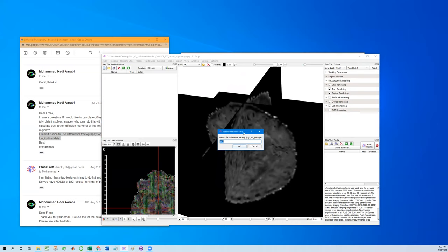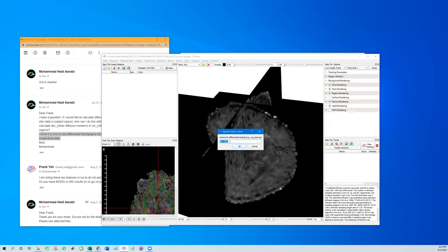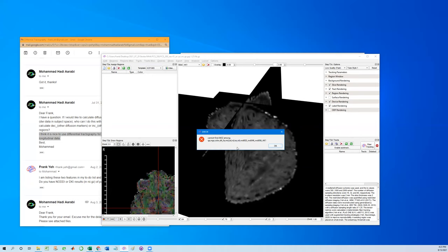To track decrease of axial kurtosis, what we are going to add is the first kurtosis minus the second one. So here the matrix name should match the one shown in the slice dropbox. So AK1 minus AK2. So any positive value from this matrix will indicate a decrease of axial kurtosis. So click OK.